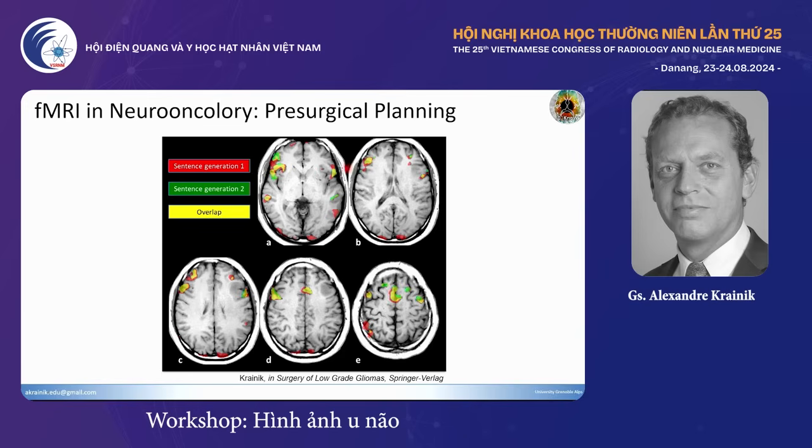And then the first results were in red, you see. And we were quite surprised because usually here you see there was a right hemispheric predominance. And it's very unusual in a right-handed subject, less than 5%. And it's very unusual even in left-handed subjects, usually 10 to 15%, but not so much. Okay, and then we were quite surprised at this patient because it changed everything.